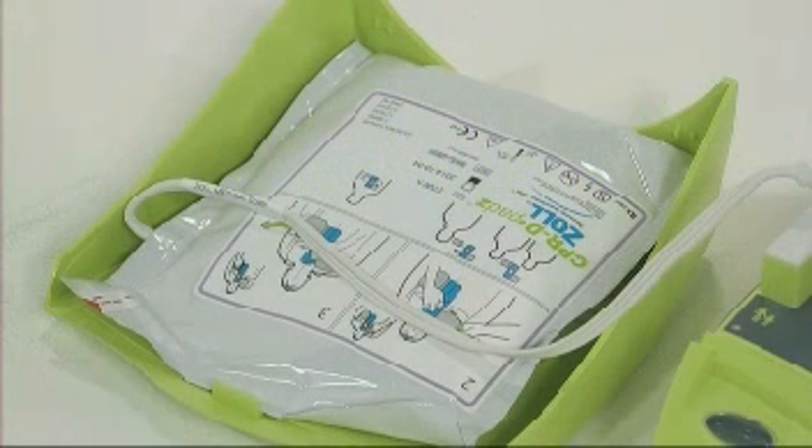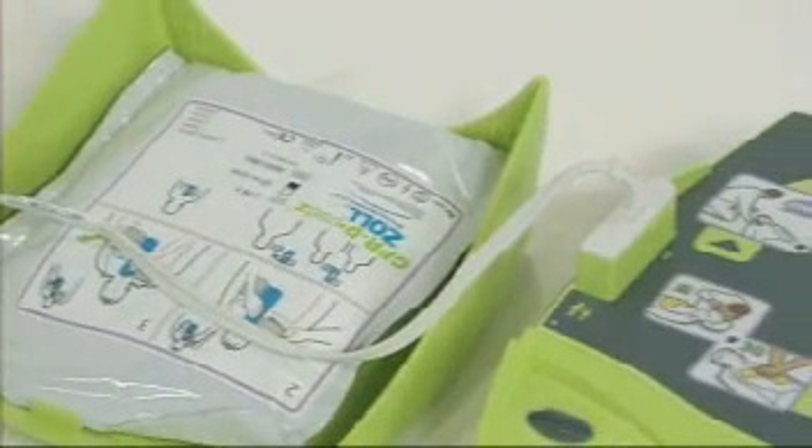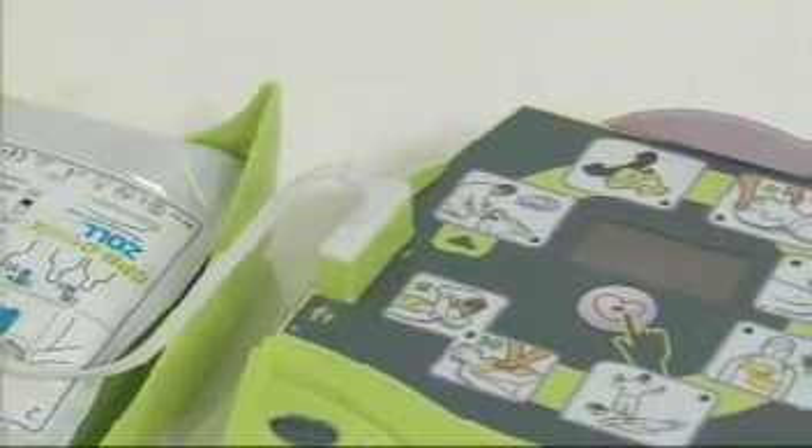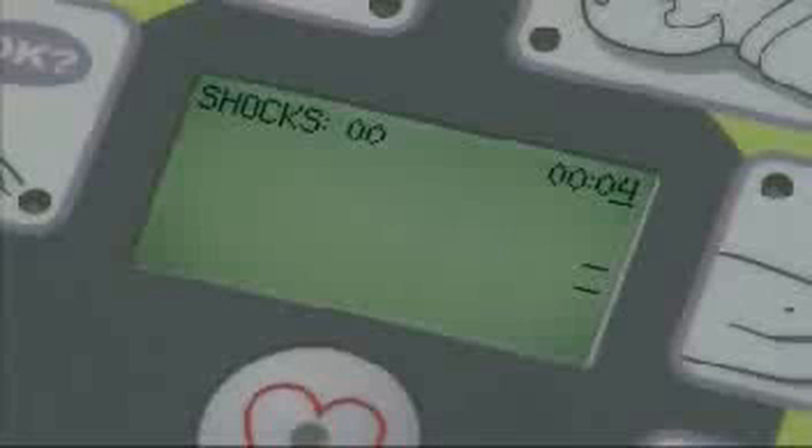The defibrillation electrodes come in a sealed pack and should be pre-connected to the AED+. If they are not pre-connected, the AED+ will prompt you to plug in the electrodes.